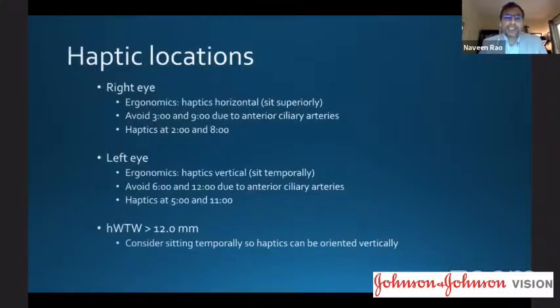That helps me avoid the cheek, where sometimes a prominent cheek can make it difficult if you're sitting temporally. The ergonomics of where your arms are, where your hands are passing the needles, it's often easier to sit superiorly for right eyes. For left eyes, the opposite. If you're sitting superiorly, you'll tend to bump into the patient's nose. So I tend to sit temporally when I'm operating on a left eye, and therefore can have easier ergonomics for the needle docking.